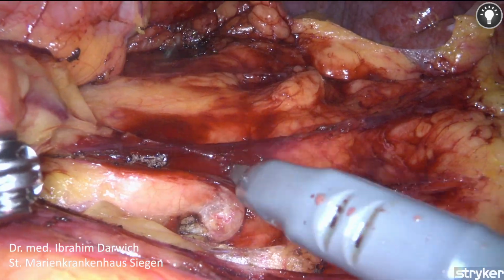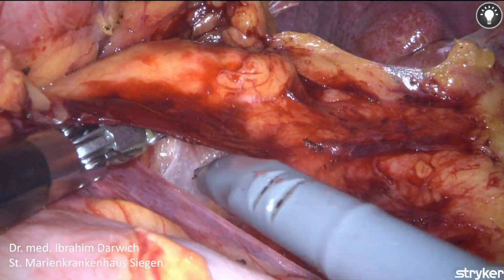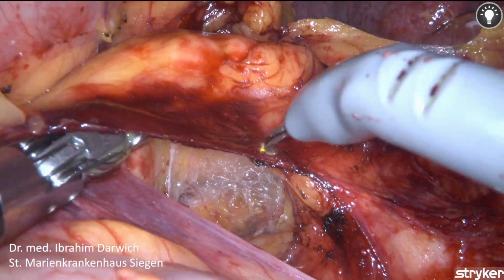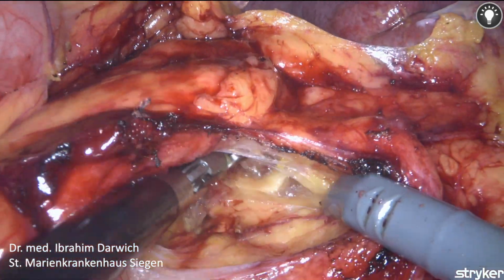The lower border of the pancreas is now clearly visualized. Dissection continues posterior to the pancreas, with particular attention given to protecting the pancreatic surface throughout this step.